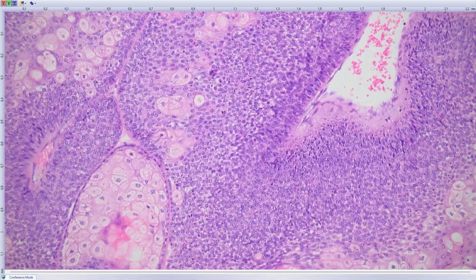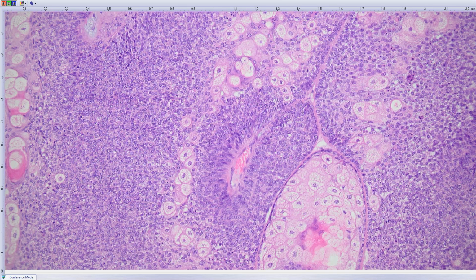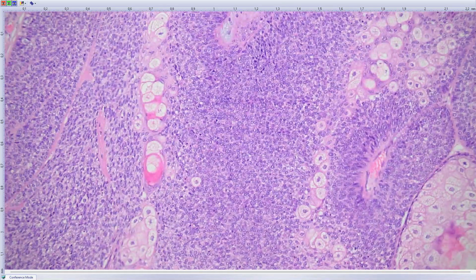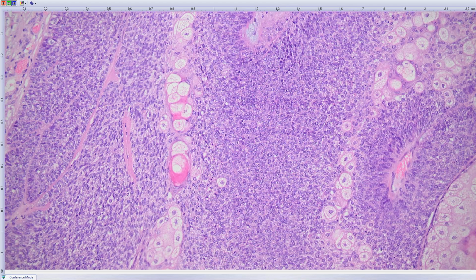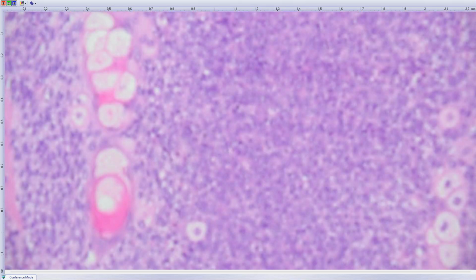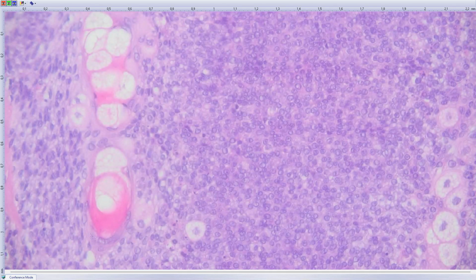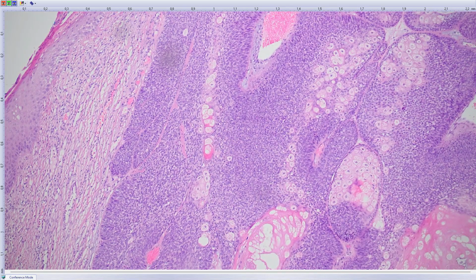My biggest problem, if I see lesions like this, is where sebaceous adenoma ends and where sebaceous carcinoma starts, because sebaceous adenomas may have quite a lot of mitotic figures, which is the case here. I'm not sure. Maybe I can show you very high magnification. I believe it's still a benign adenoma.